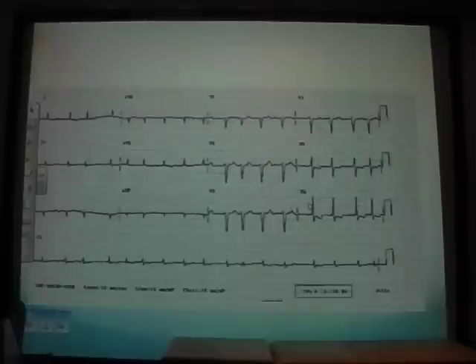Sorry, is the T-wave inversion in any particular place? Is it typical to be in V5, V6? I think it's possible that it could be elsewhere. I think it was just clearly here in V5 and V6.